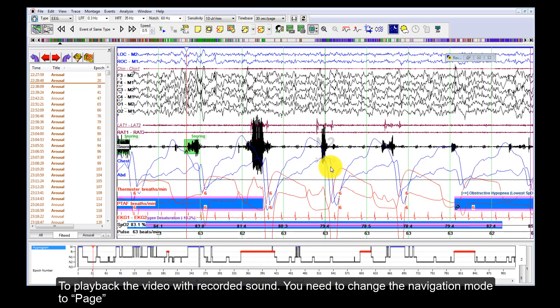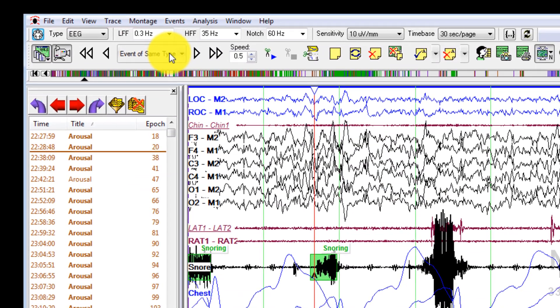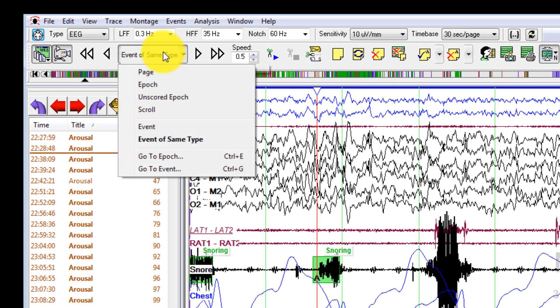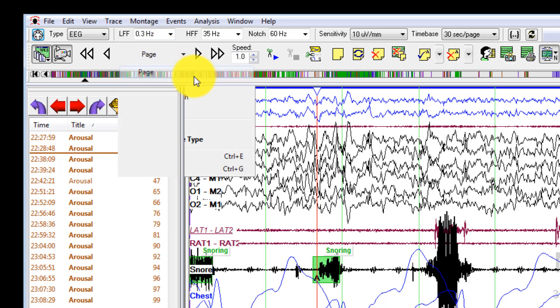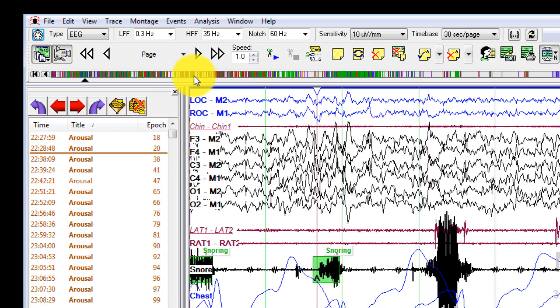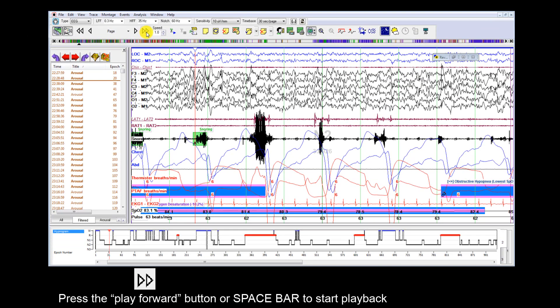To play back the video with recorded sound, you need to change the navigation mode to Page. Press the Play Forward button or spacebar to start playback.